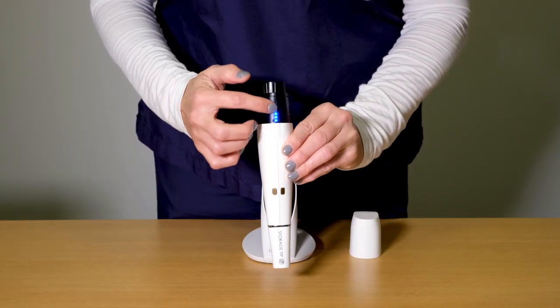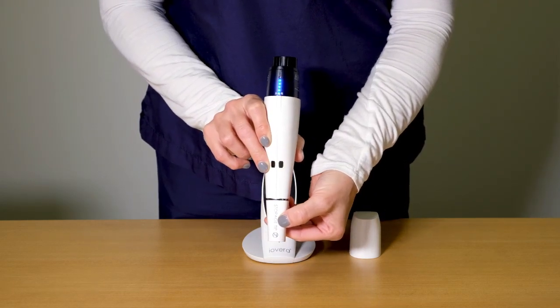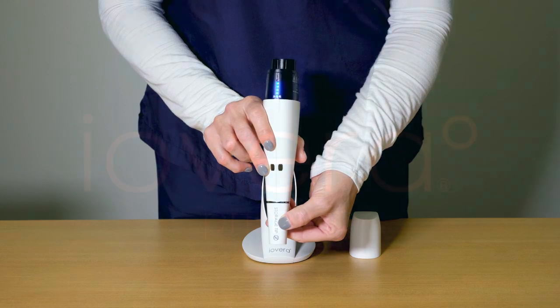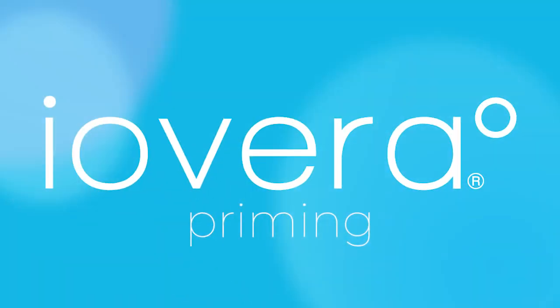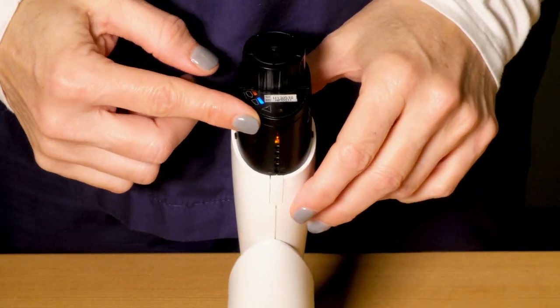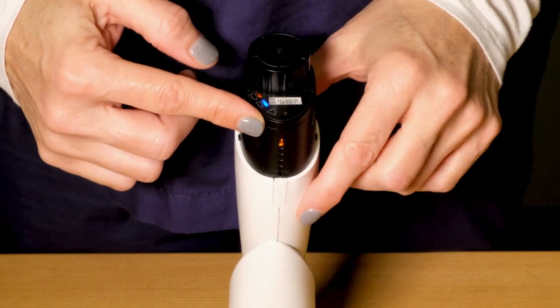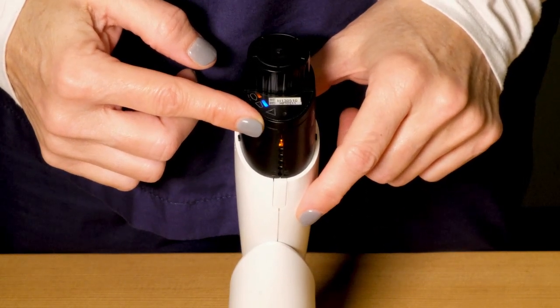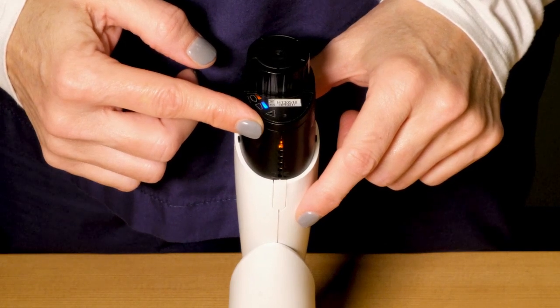On the back of the handpiece are the treatment status LEDs, and below is the storage tip. The solid orange LED on the back of the iOVERA handpiece indicates the device needs to be primed. Priming ensures the iOVERA system operates correctly. Skipping priming can affect system performance.